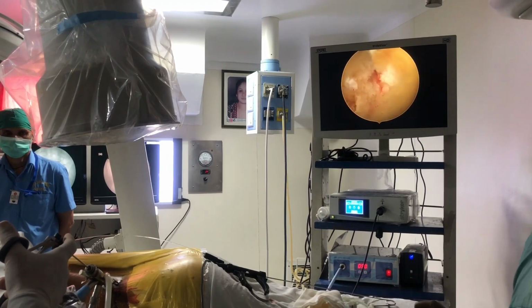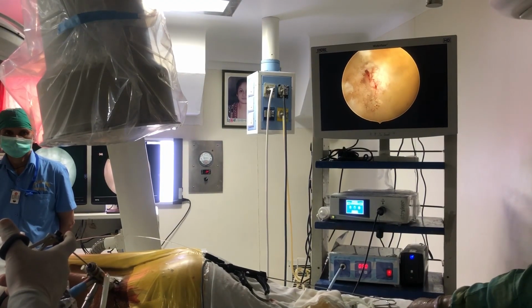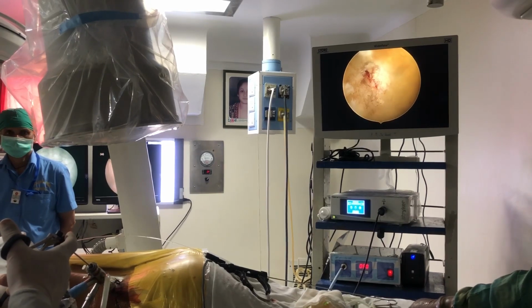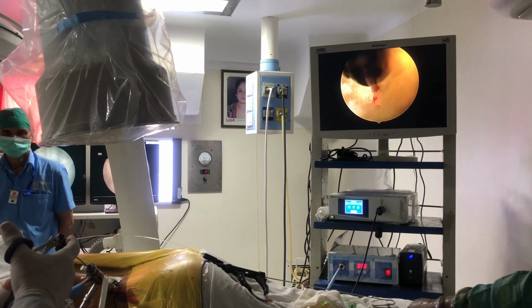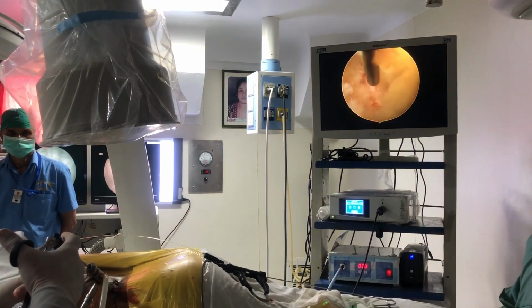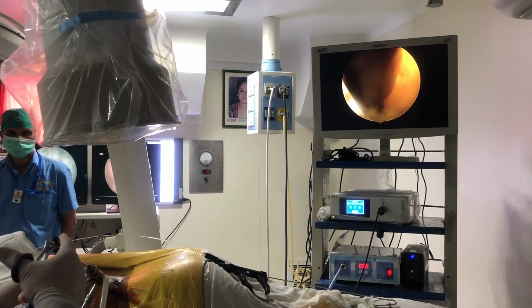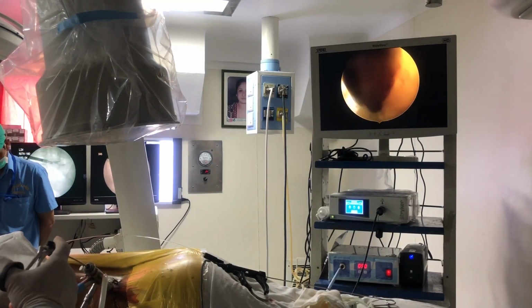The bleeding is coming from the rent. Can you see the rent please? This is the rent in the annulus, which I am now pointing to and probing with my hook. It is from this rent that the patient was getting chemical sensitization of his cord and was getting pain.